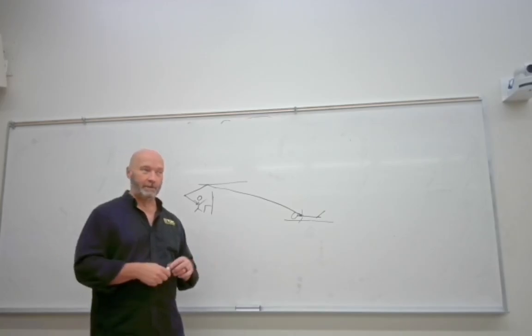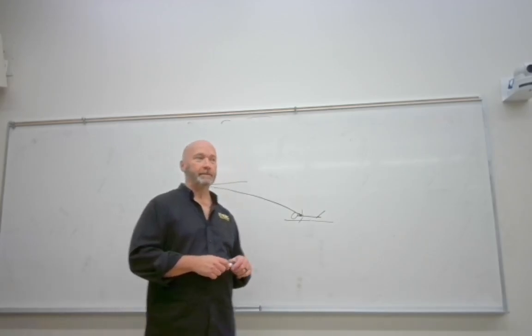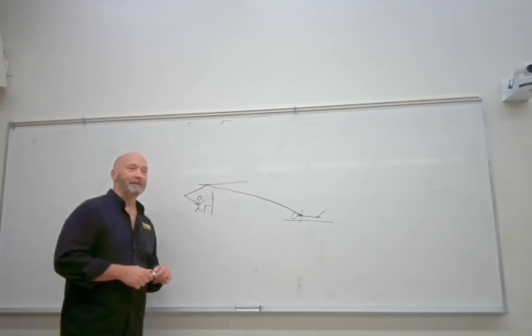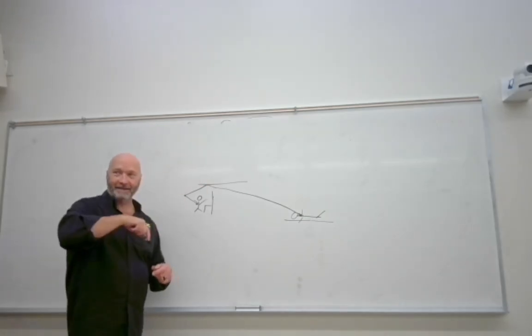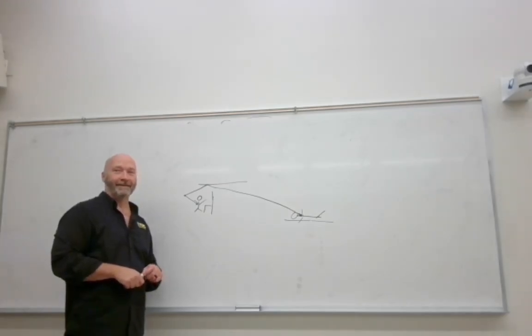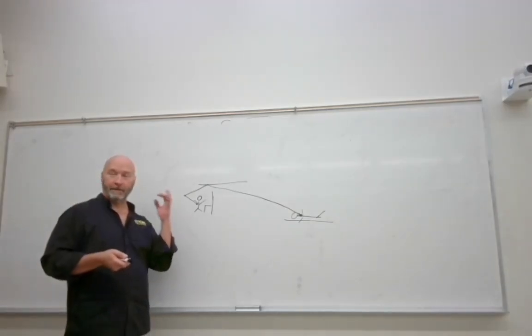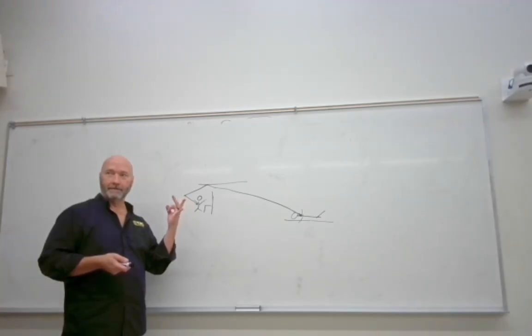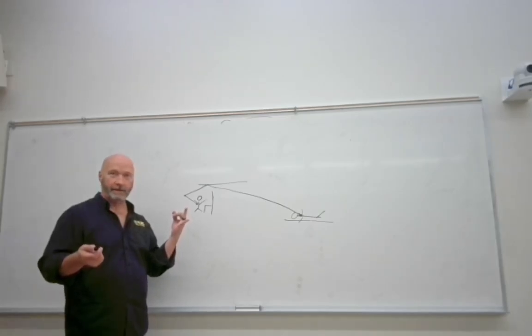What kind of kVp did we use on fluoro? Right? So let's take it all the way back. How do you limit your radiation dose? Inverse square. Okay, because of the inverse square law, you've got 3 things. Time. So don't be in a room if you don't have to be.